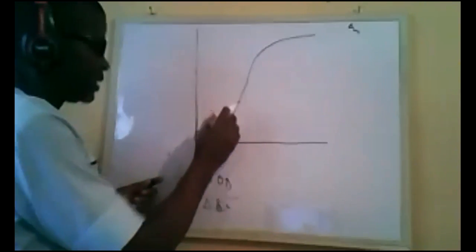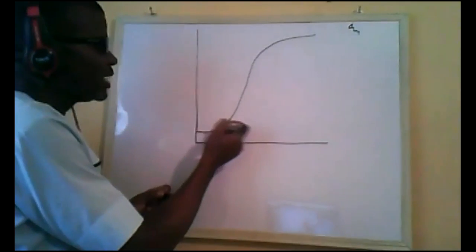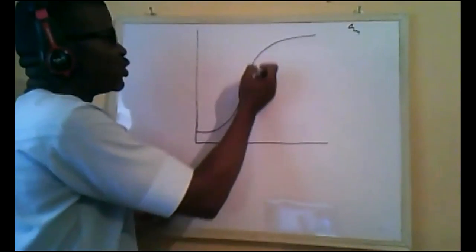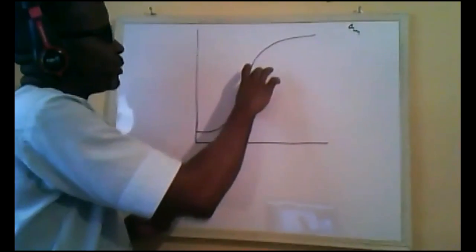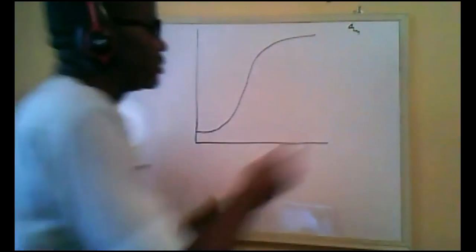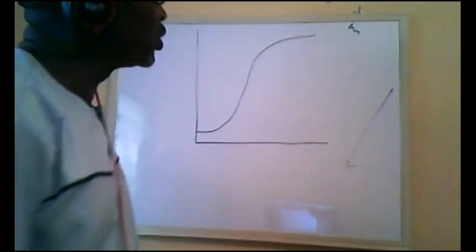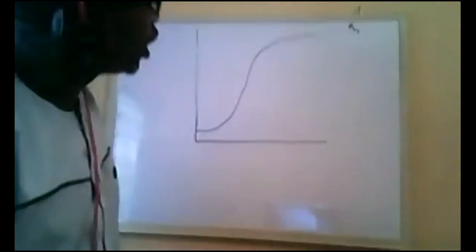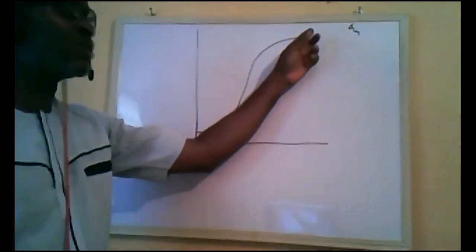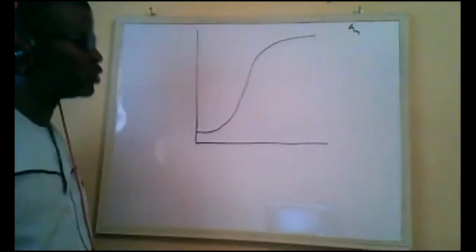As we continue moving, at each point we are going to be having various different gradients until we get to this linear region. At this linear region, the gradient at each of the points will always be the same, because the gradient of a straight line is the same. There is no change at any point. Likewise, if you get here also, our contrast, sorry, our gradients will eventually turn to 0 again.